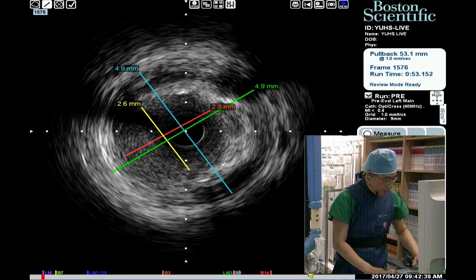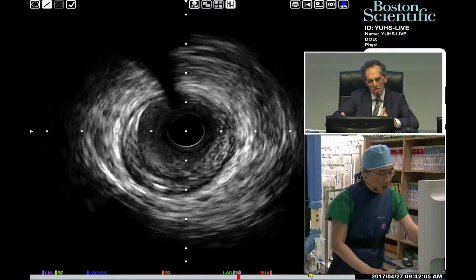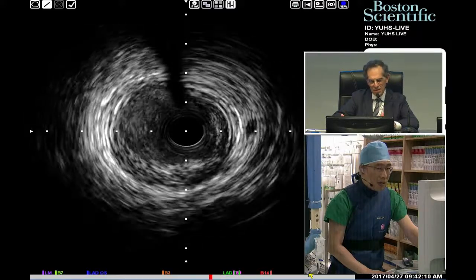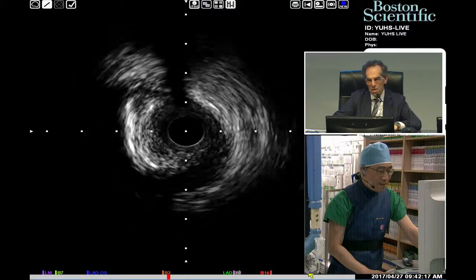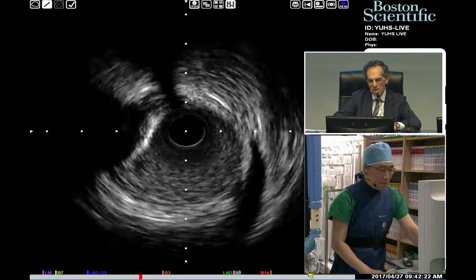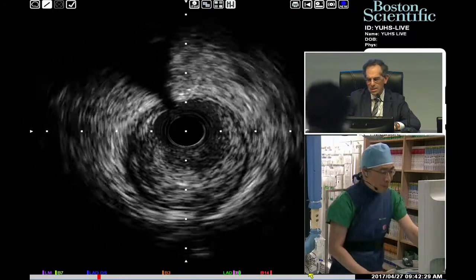Kim, I have a question. The question is how to evaluate the intermediate lesion on the left main. You know that there is a strong concordance in the left main between IVUS and FFR. But you chose IVUS since the beginning. The catheter was a side-hole, which is not the best one for assessing FFR. So why did you choose IVUS? Because you trust IVUS more when you have to judge an intermediate lesion, or why?